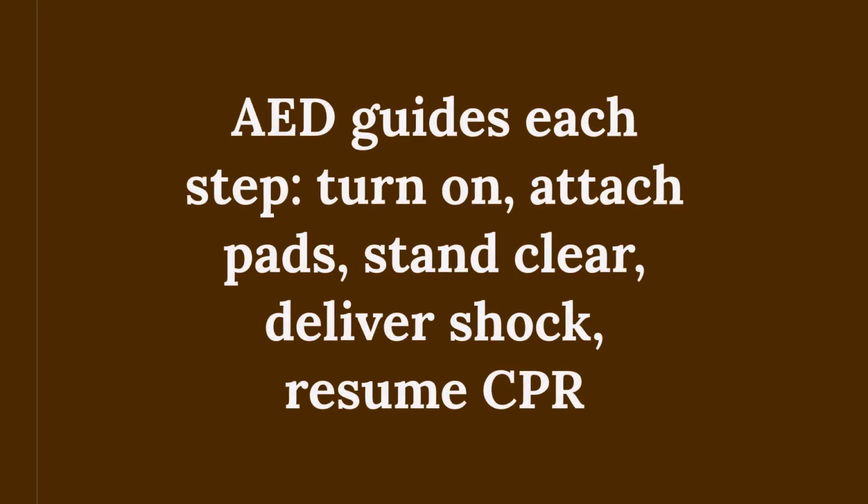Turn on the AED and follow prompts. Expose the chest and attach pads as shown. Stand clear during analysis and shock. Deliver the shock if advised, then resume CPR. AEDs guide you through every step.